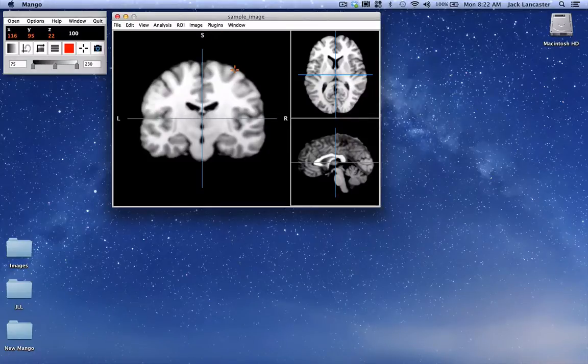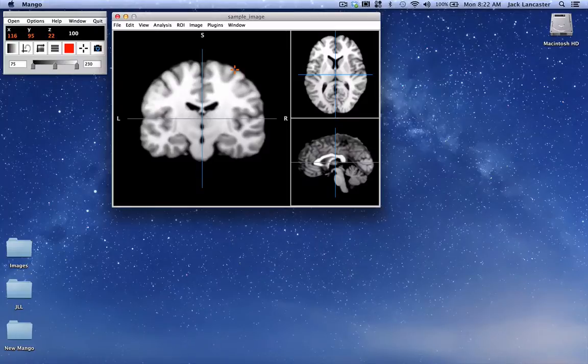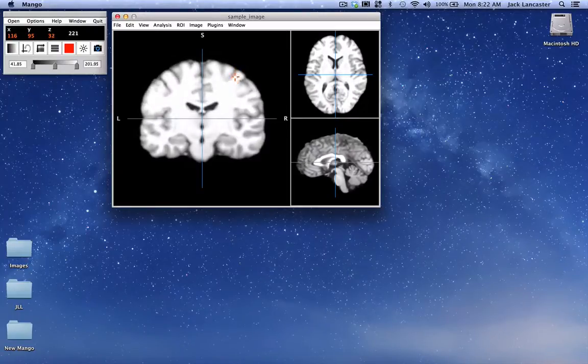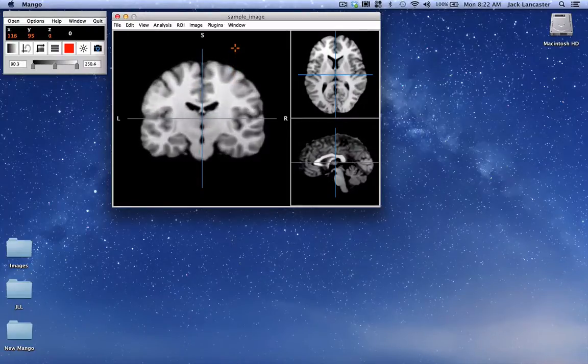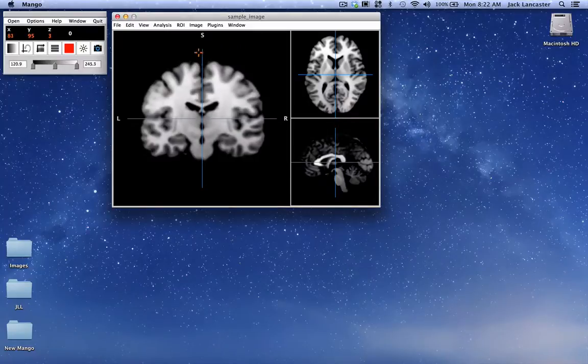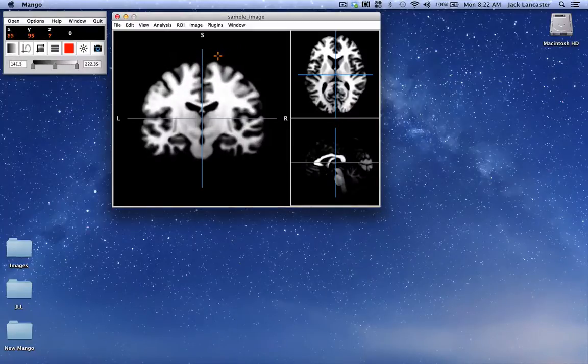We've added several features to the mouse right button. If you press the right mouse button and move up and down you get brightness control, left and right contrast.